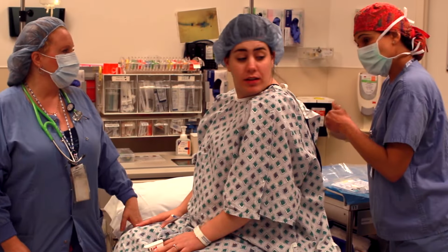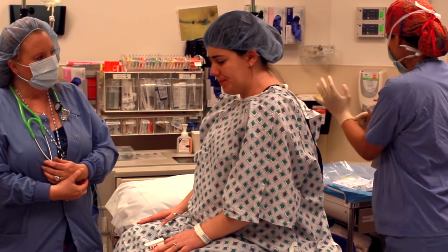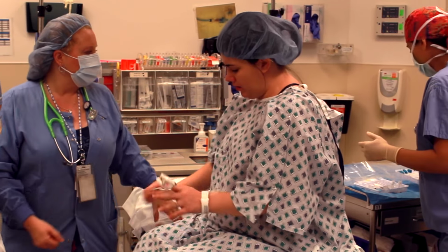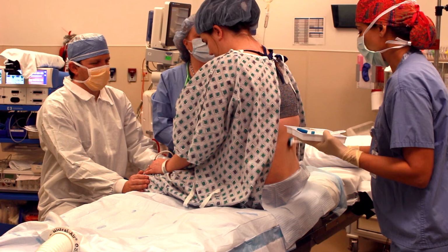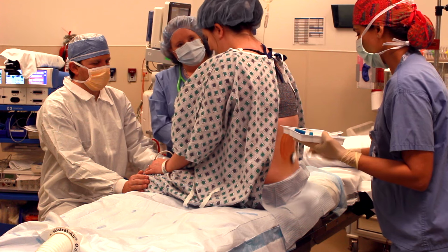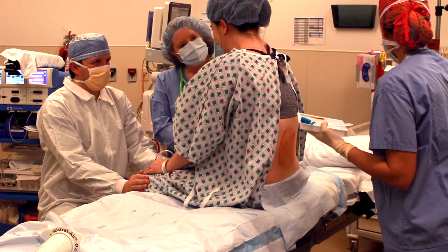I will let you know what I'm doing every step of the way. Okay? And first thing I'm going to do is clean off your back with a cold soap. Okay? So here's the first 3 times. That's good. Get to meet your baby.